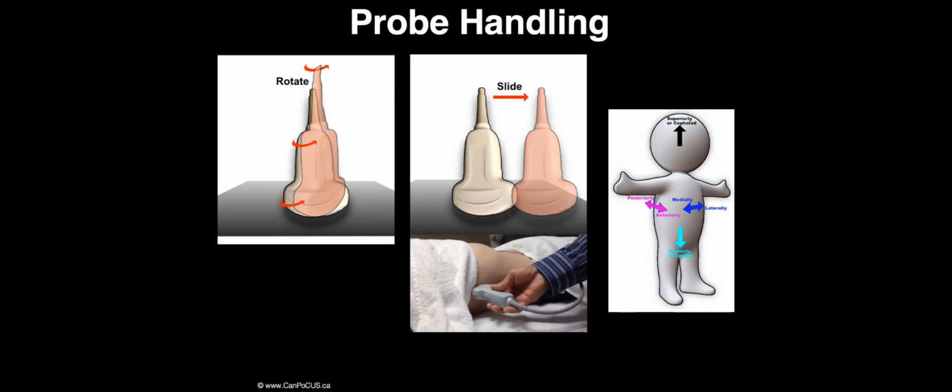When considering directions, remember the anatomical terminology. Towards the head is cephalad or cranial, towards the feet is caudal, towards the midline is medial, and away from the midline is lateral, and finally there are anterior and posterior movements.